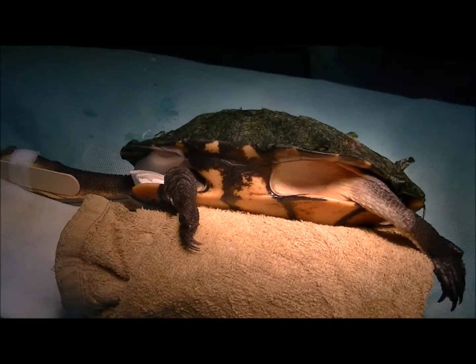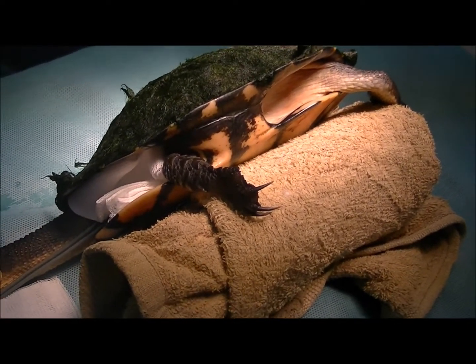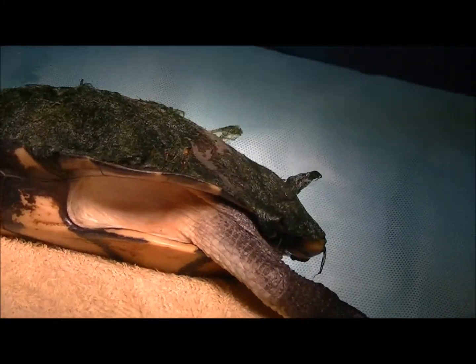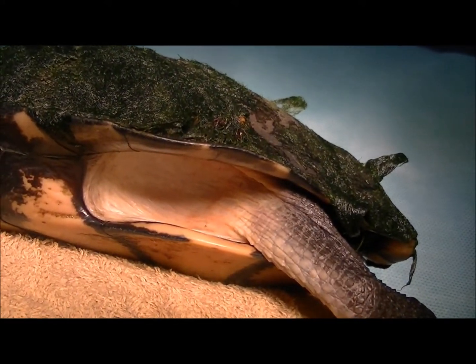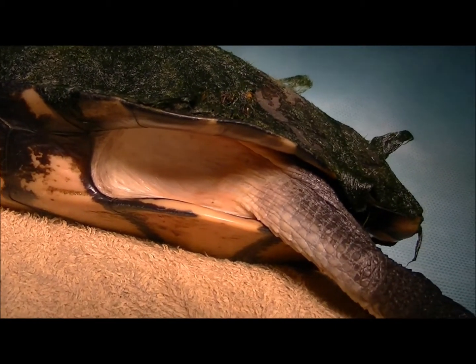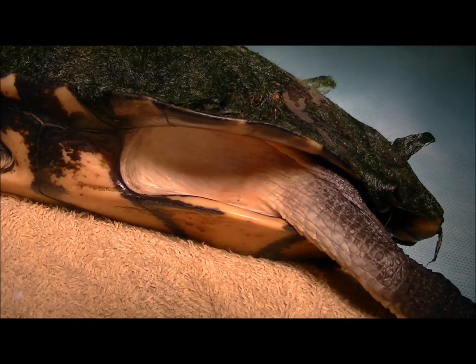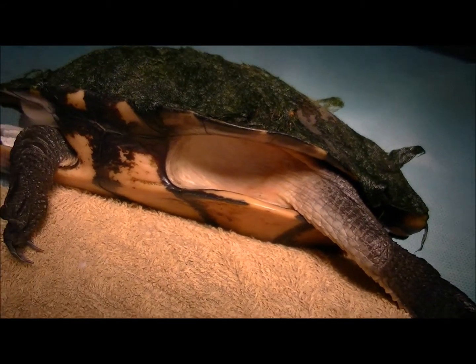I've got it positioned laying on her side, resting on a towel here, and the reason for that is the access point is down here in front of the rear left leg. So I'm going to make an incision down in that skin, go through the muscle, find her stomach, open her stomach up, get the hook out, close the stomach up, and close the skin up.